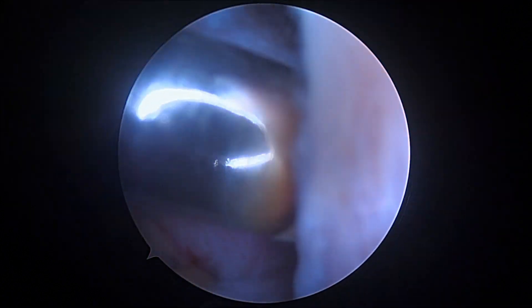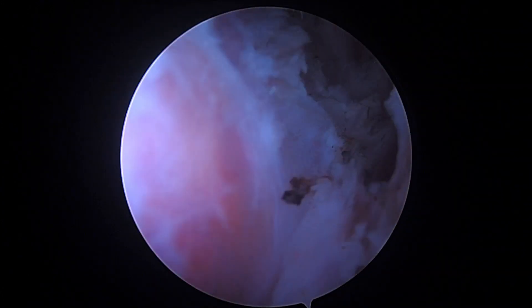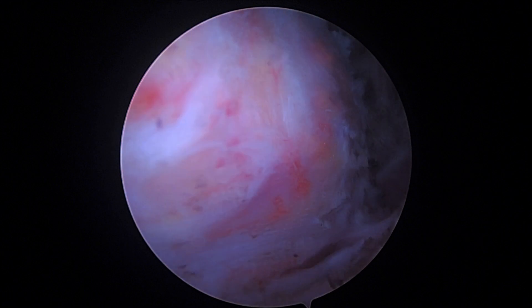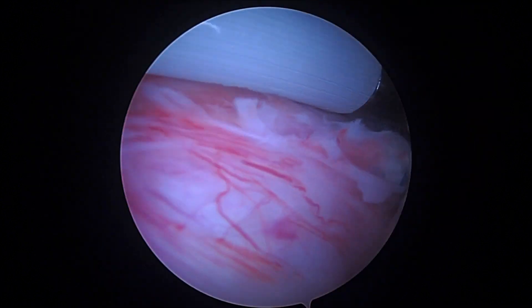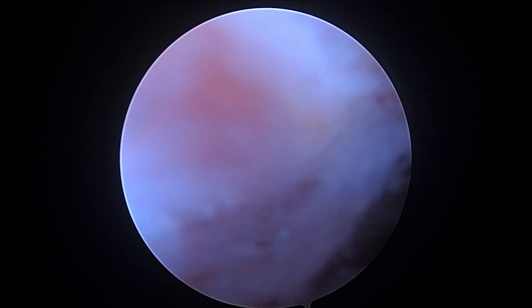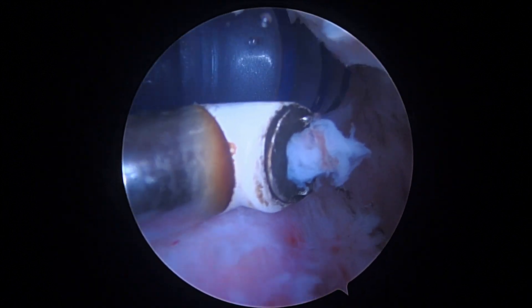As we come up here more to the front — I'm rotating your shoulder here — and I'll tell you, that doesn't look bad. I'm not seeing a big gap. There's that one suture we can still see. Even as I slowly work my way lateral, I'm not seeing any significant detachment. There on the right, that's our anterior cannula.